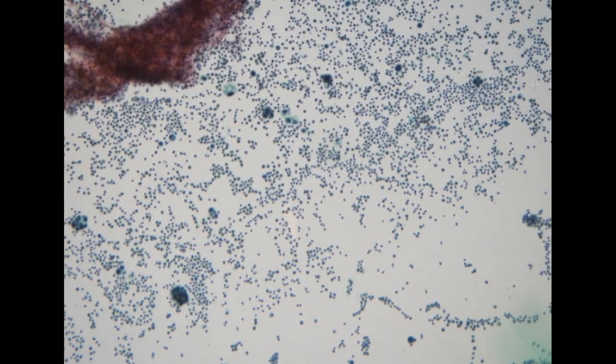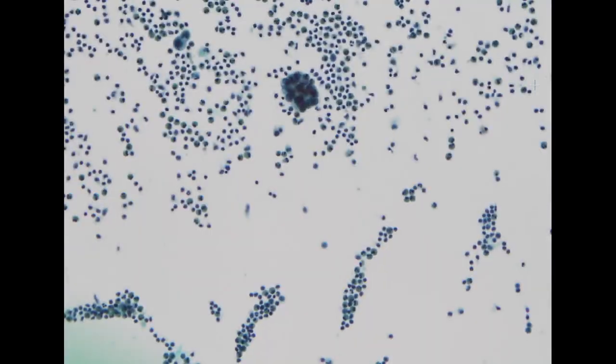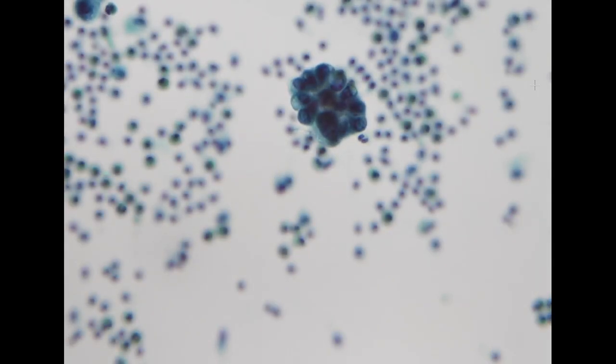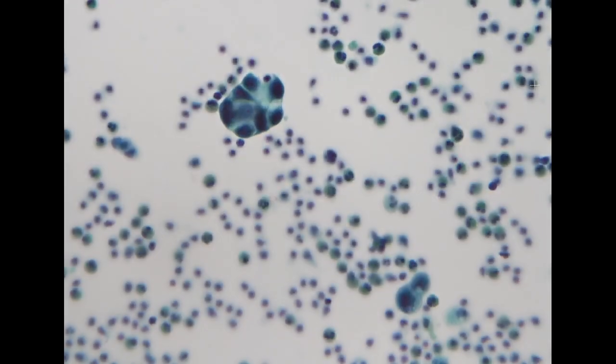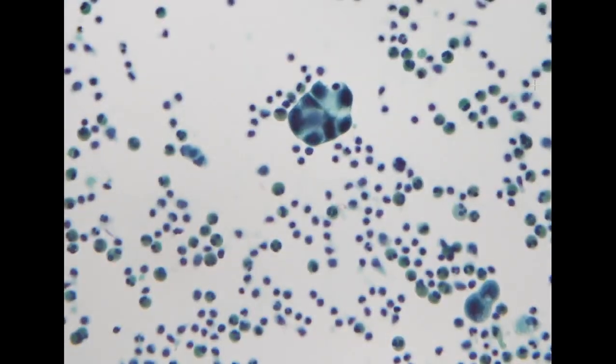So we had a couple lung cancer. This one is from a pleural effusion with a patient with a known history of primary lung adenocarcinoma. So we see a cell ball, a three-dimensional cell cluster arranging in a glandular pattern. So this is compatible with primary lung cancer recurrence.